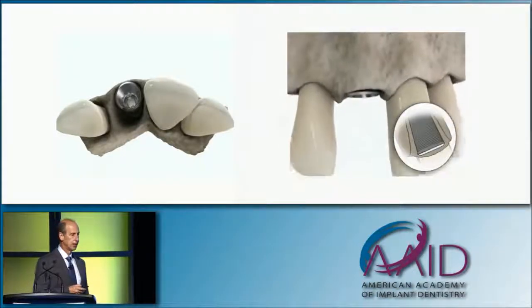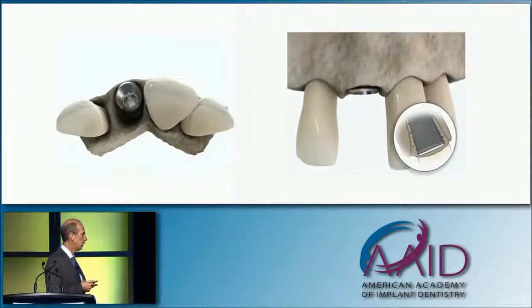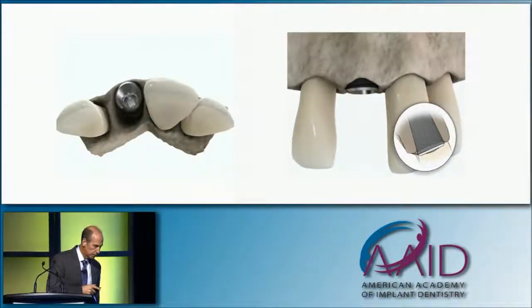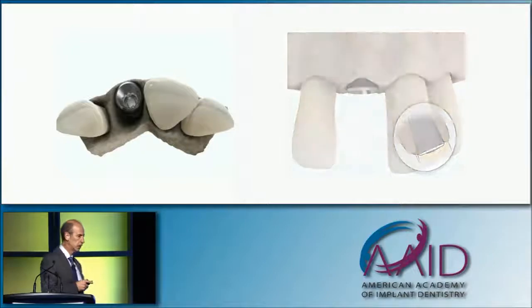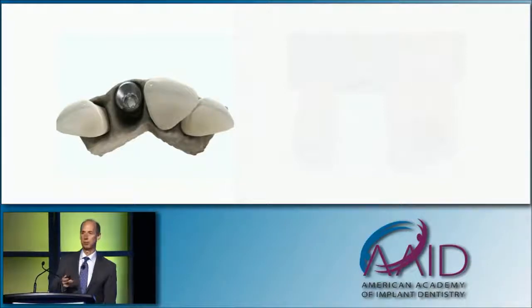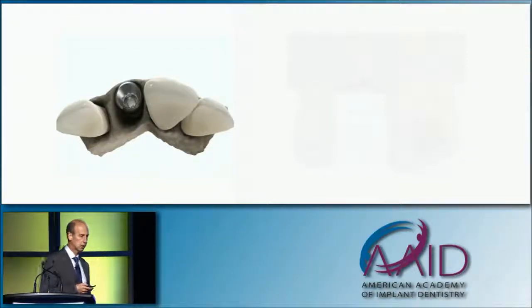You see, we learned a long time ago that there's a very specific place one places an implant in a socket, and that is palatally away from the buccal plate of bone. So as these new surfaces with improved implant osseointegration are placed in the socket, it allows bone to heal much more rapidly than bone resorbs. And that's a very critical point. If the implant is up against this buccal plate of bone in this incorrect position shown here, nothing but resorption can follow.